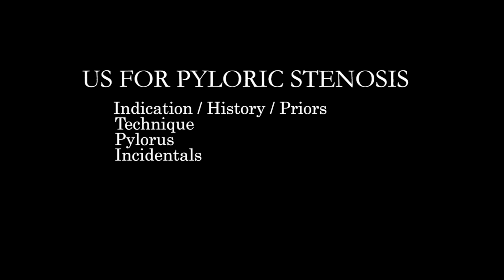So the basic overall structure of what we're going to do is you want to understand what is the level of clinical suspicion, what are the patient demographics, any sort of risk factors. And then you also want to get a sense if there's any prior imaging.